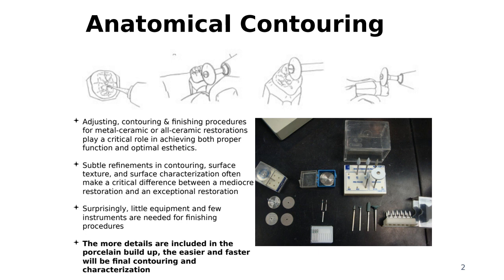What a tooth is, right? If we have a molar, and you have a younger person, and you look at their molars, the cusp tips are more pointy. The grooves are deeper, right? The secondary anatomy is there. You look at an older person, not that much.